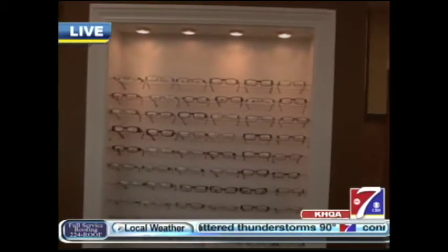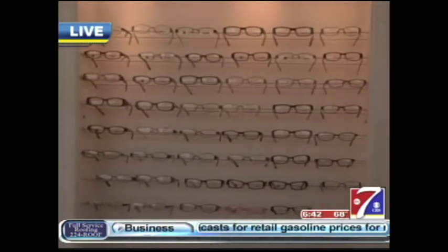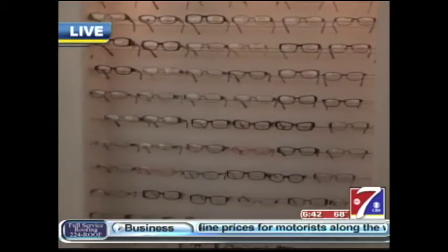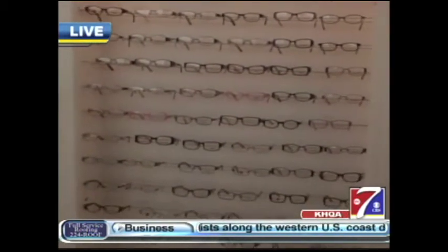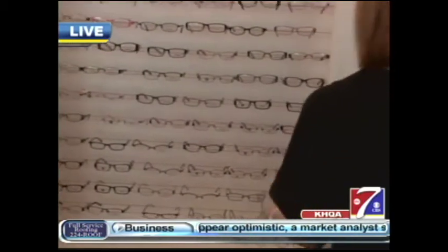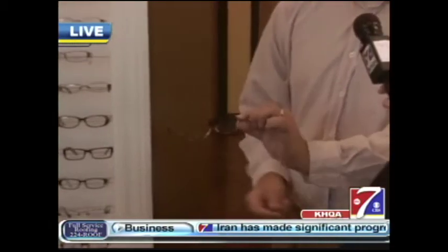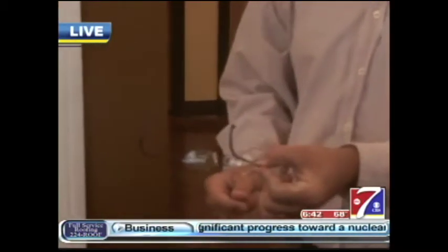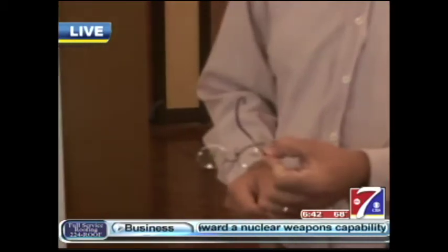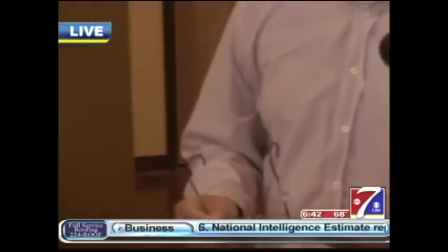Then the thing we look for with fit with kids is width of the face, also the size of the lens in reference to what they need for their prescription. Fit around the ears. A lot of kids have a hard time with them sliding off, or they're very active. So when kids are very active, we have to find frames that can stay on their face a lot easier. These frames right here, for instance, they may not look the greatest, but they fit kids very well with the back temples there that wrap around the ears. They stay on a lot easier. We can adjust them a lot better.